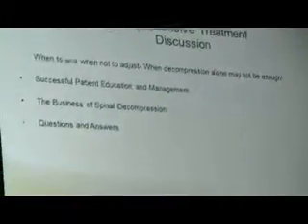When and when not to adjust. You know when to adjust. Just don't adjust prematurely. Get some clinical improvement first. Get some reduction in spasm. Then go in there and make the adjustment. Successful patient education and management. Tell them what you're doing. Be sincere. I run a cash practice. I also run an insurance practice. So when I do a specific adjustment, I bill for that. When I do M3D Extentrac Decompression, it's cash. And it's non-ending cash. In this insurance environment, I know what you're all going through.